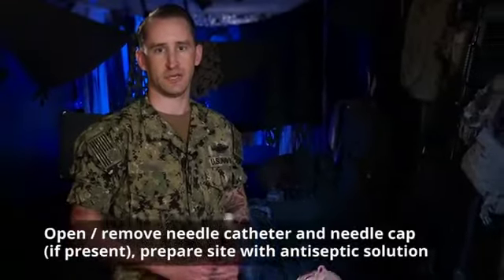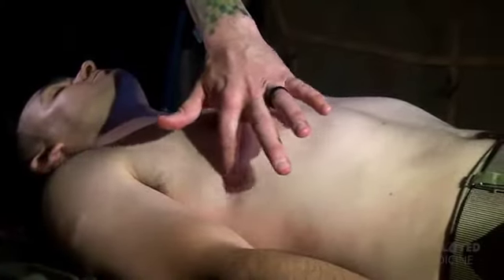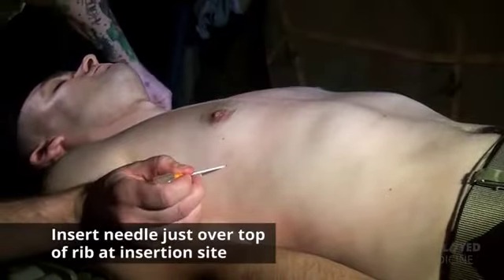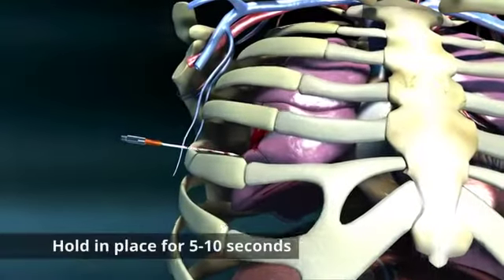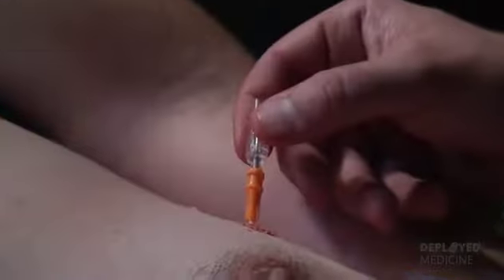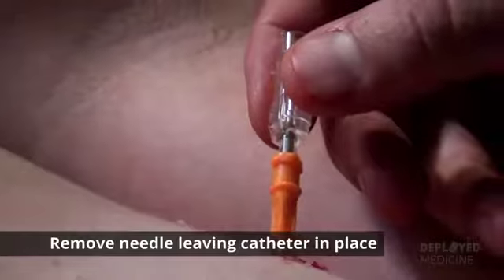Once you've identified the site, take your 10 or 14 gauge 3 1/4 inch needle catheter and begin your insertion. Following the anterior axillary line, I'm going to insert my needle just over the top of the lower rib at the insertion site. Insert the needle catheter unit all the way to the hub and hold it in place for 5 to 10 seconds to allow decompression to occur. After the NDC has been performed, remove the needle, leaving the catheter in place.